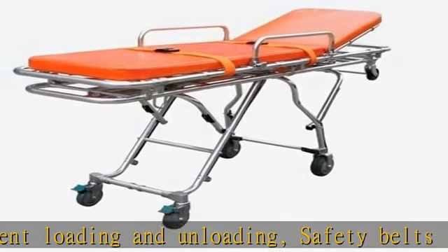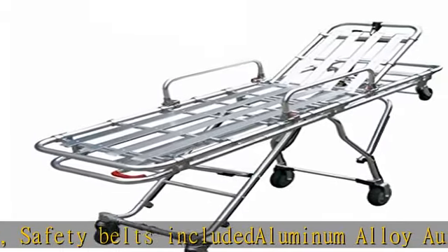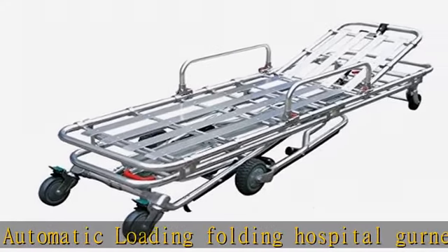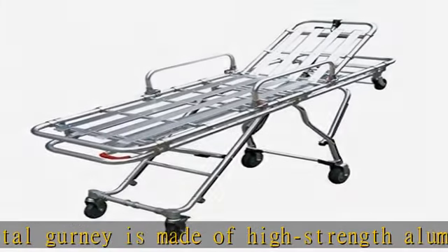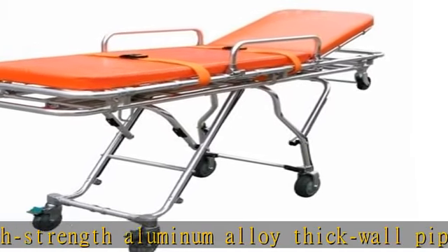Trendelenburg 25 degrees. Reverse Trendelenburg 11 degrees. High position: 77x22x38.5 inches. Low position: 77x22x13 inches. Weight: 86 pounds. See the description to get this product today at the best price.